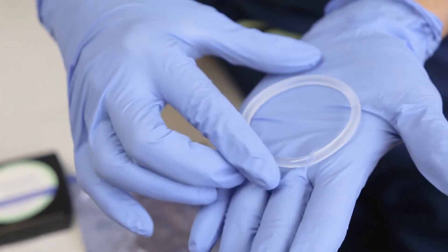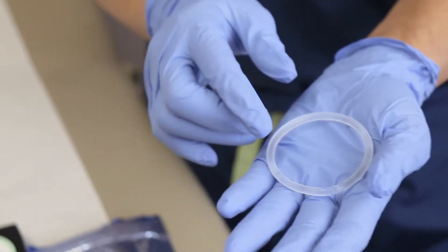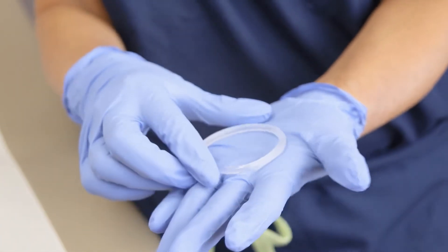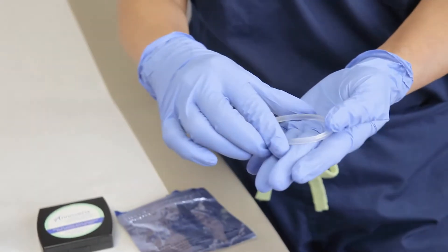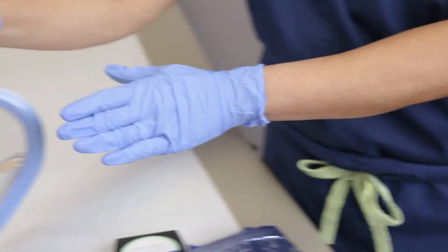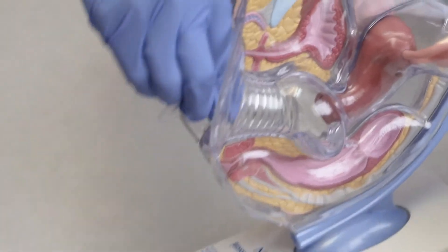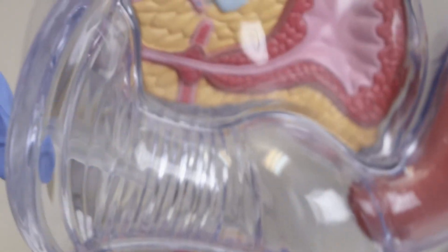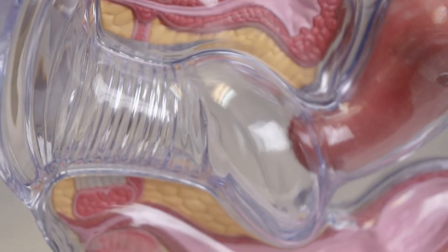What you do is at the beginning of your menstrual cycle — which will be day two to five — wash your hands, take the ring out of the packaging, and squeeze it. I'm going to show you on this model. Squeeze it and put it in the vagina, just like you put a tampon in. Once you put it in, it opens up, and you just push it with your finger and it will go and sit there.